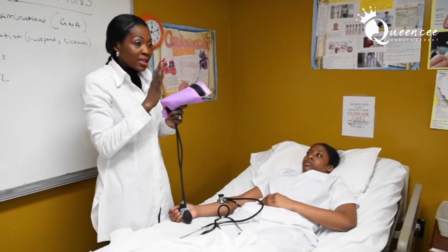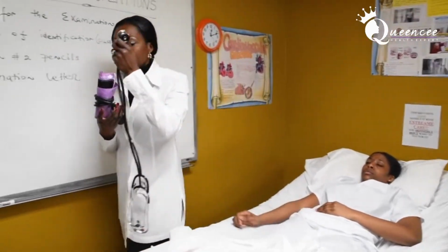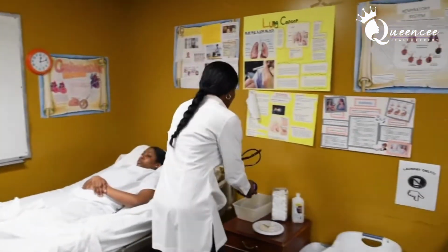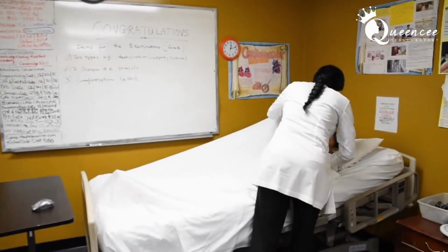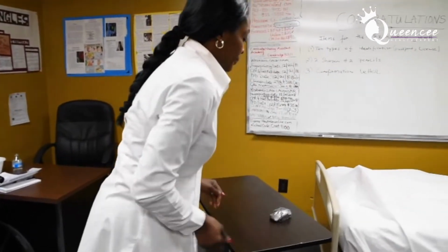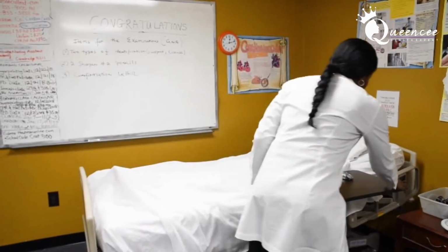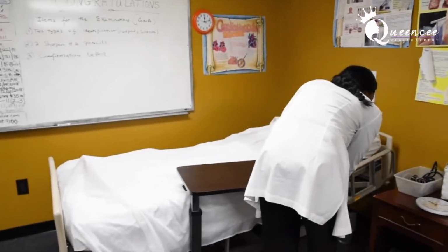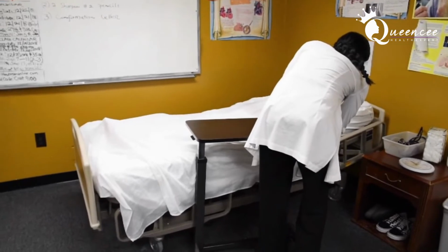Okay, so you do the same thing without saying anything to the examiner. I unwrap the cuff, return my equipment where I got it from, quietly, not speaking to the examiner concerning my numbers. The number is in my mind, okay. Call light. I brought the bed all the way up, so I have to return it to the lowest position for real in order to get credit for it.